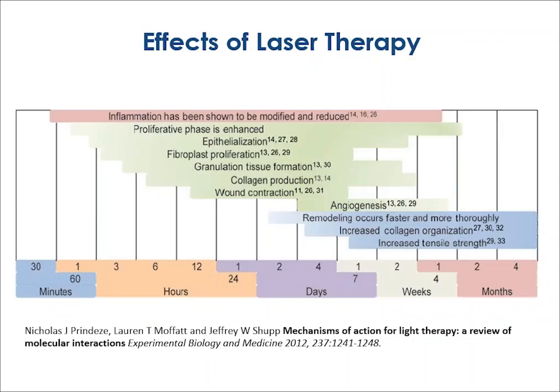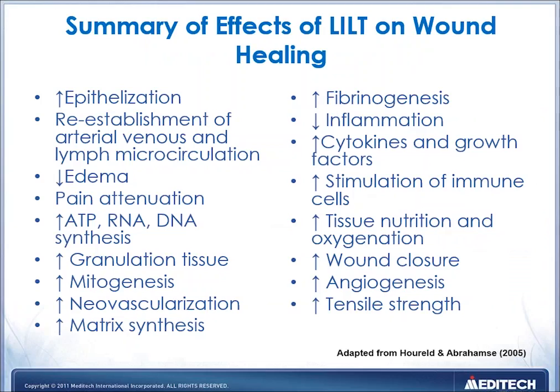So the effects of laser therapy, as most of you are already familiar with the fundamentals of laser stimulation and the mechanisms behind it, you know that laser helps us accelerate the phases of inflammation, pushing tissues further and closer to the final phase of cellular proliferation, tissue repair, and regeneration. So this will include angiogenesis, collagen production, and remodeling of tissues. So, a quick summary of the effects of laser on wound healing.